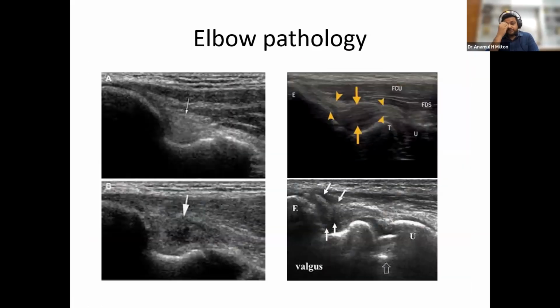Okay, the pathology. Here we can see the thickening. If we see the distal part, there is not so much thickening, compared to the proximal part near the sloping area. So this is the thickening. There is degeneration, and there is an anechoic area, so some small tear or partial tear is there. And when it involves almost the whole substance, that is a near complete tear.